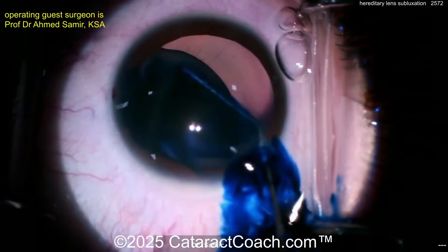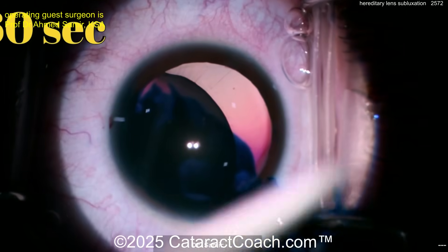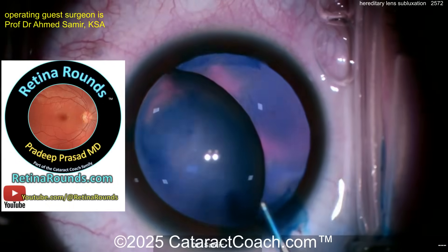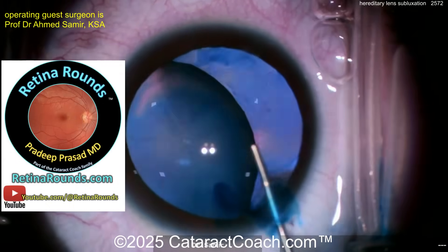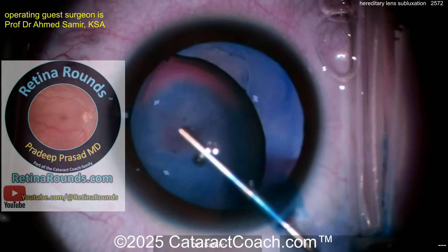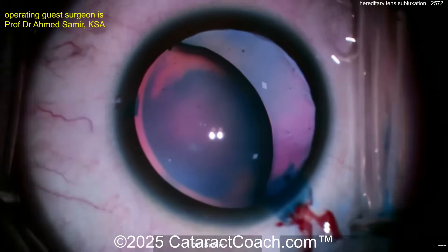A little bit of trypan blue dye — this is a special trypan blue dye, much stronger than typical, and the surgeon is going to leave it on the lens for a long time. Notice it's not going into the vitreous cavity. If you push that dye into the vitreous cavity you're going to have to do a vitrectomy — so learn from retinarounds.com, our amazing sister channel.